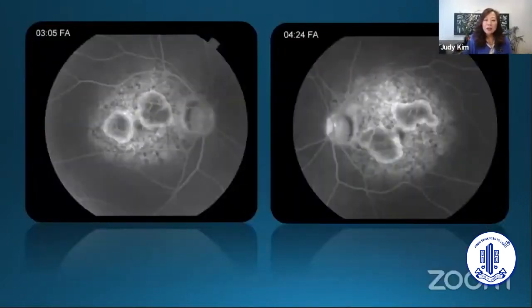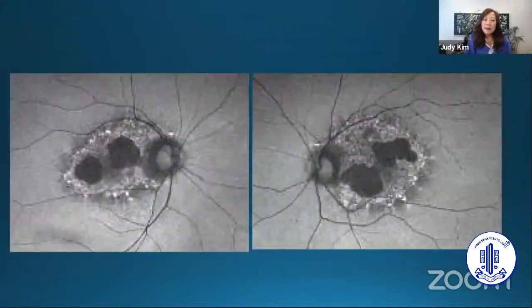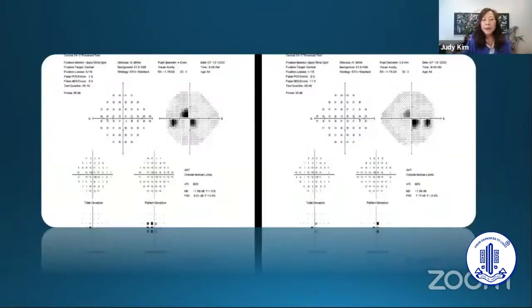And then this is the fluorescein angiogram. So mostly a staining defect. Nothing was really leaking per se. This is fundus autofluorescence, which I thought was quite striking. Those large areas of atrophy are hypoautofluorescent. But then this hyperautofluorescence was pretty much throughout the posterior pole, and very confined to the posterior pole only. And indeed, she did have areas of visual field defect pericentrally. Her complaints of scotoma were validated.